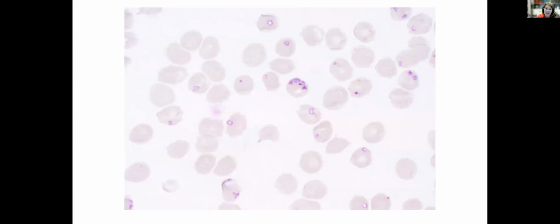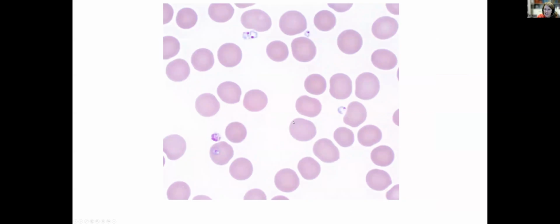Now, I have to say that in the parasitology laboratory, the thing we see the most often is the pleomorphism of size and shape. This is a case of babesiosis. You can see small rings, larger rings, rings that look like they have little things coming off of them. This one looks a bit like a tennis racket. Very small oval-shaped parasites. Now, if you see again that Maltese cross, that's great, but in actual clinical practice, it's hardly ever seen. And then nice extracellular parasites tend to be pretty common with Babesia.